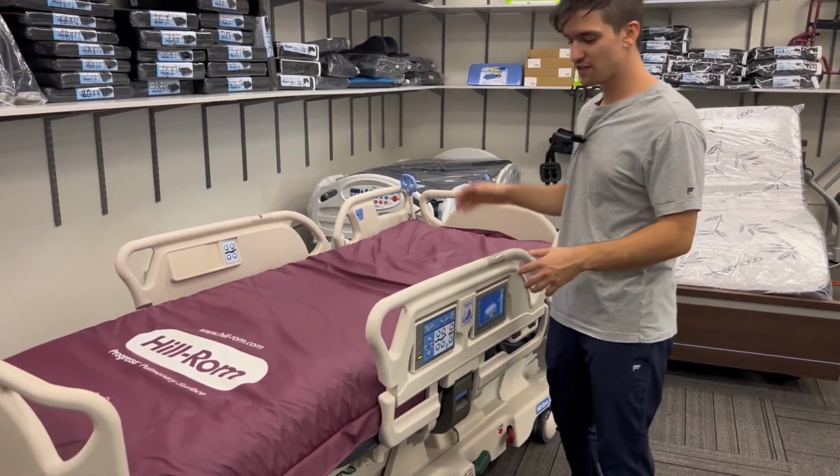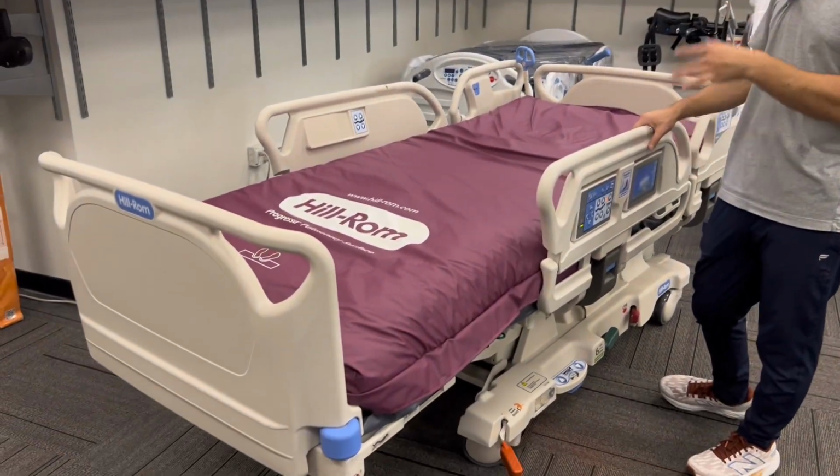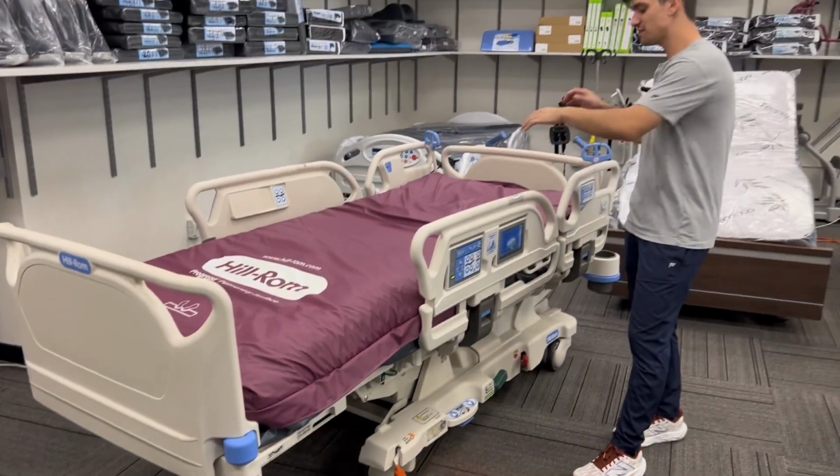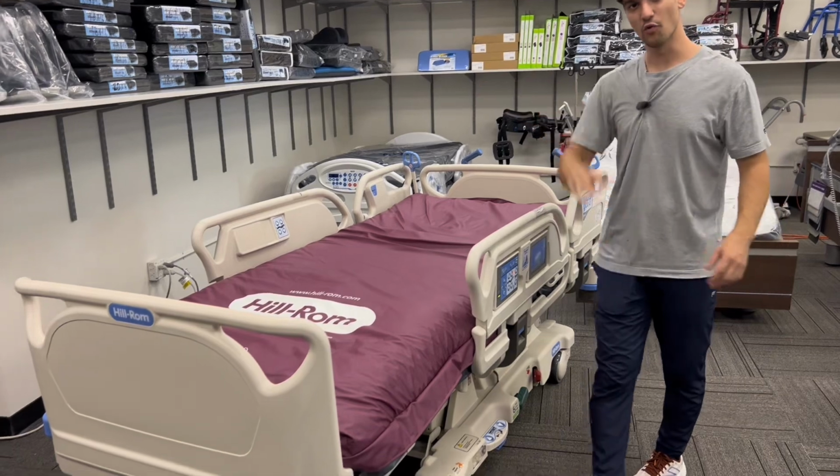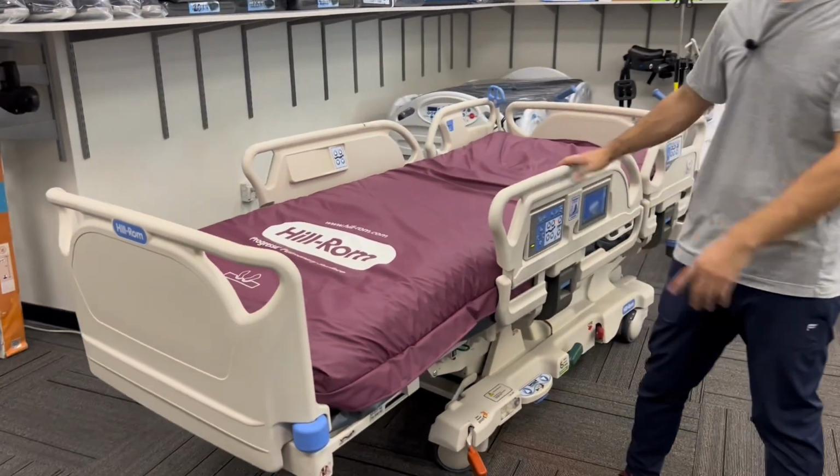We're going to be going over in this video the Hill-Rom Progressa pulmonary therapy surface. So this is a hospital bed frame that comes with this built-in air mattress system. We're going to go ahead and dive in and look at all the different features that this hospital bed offers.